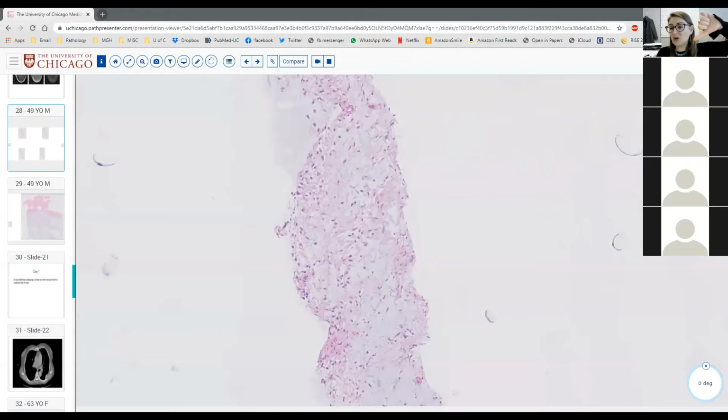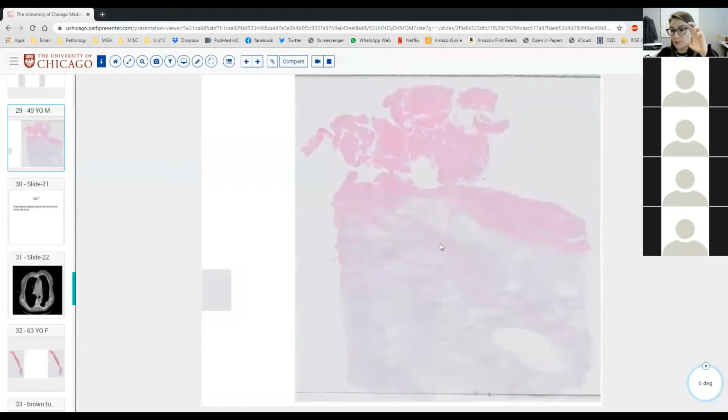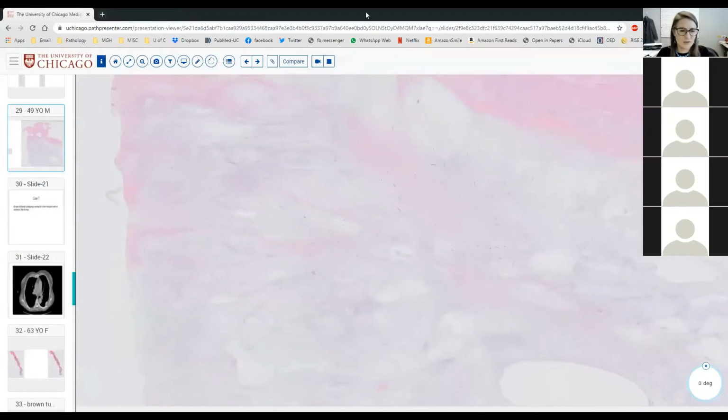Not really. If you're thinking to exclude a nerve sheath tumor, you can say it's S100-SOX10 negative. If you're thinking to exclude a carcinoma or melanoma, sure. But otherwise, these are basically non-specific immunohistochemically. They may have a little CD34. They may have a few histiocytes in them, so some CD68, but nothing strong or consistent with actual fibroblast, myofibroblast type cells, right? They're just nondescript, a diagnosis of exclusion.